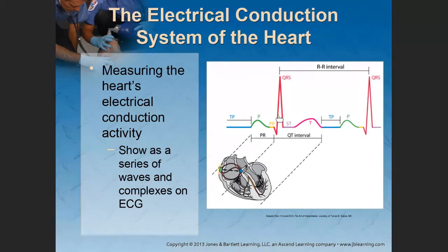All right. So let me use a pencil so you can see exactly where I'm talking. Right here is the width of the QRS complex. The width of the QRS complex should not be greater than 3 small boxes. So let's say the QRS complex is out here.